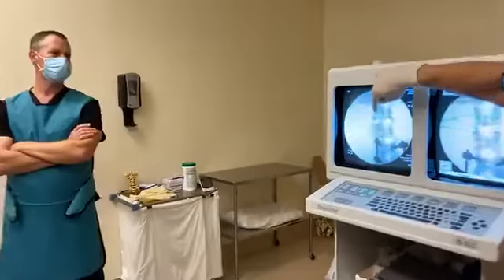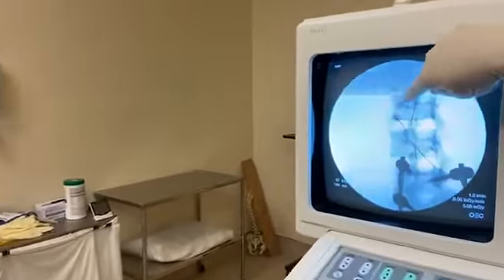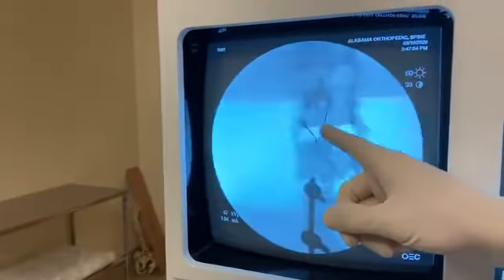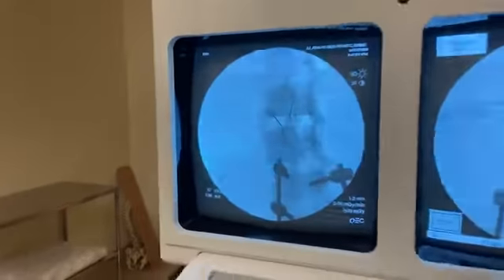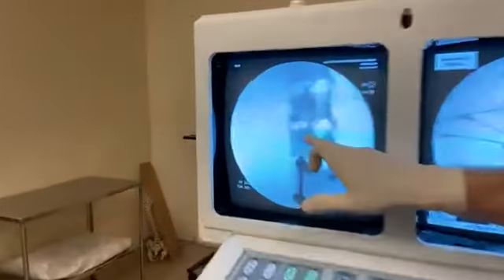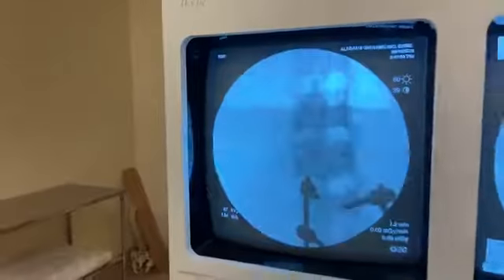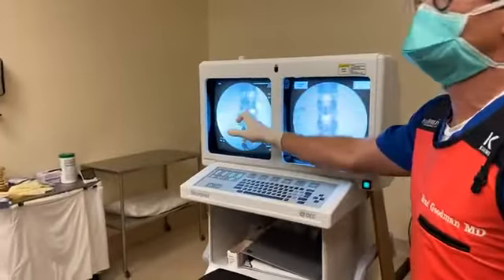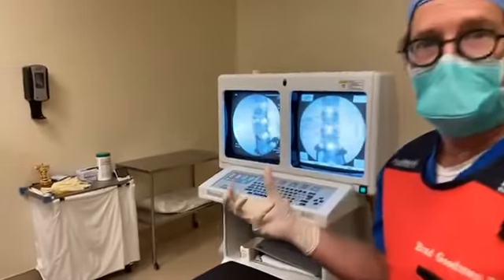Okay? These two needles are really blocking needles. This would be the RF needle, and this is a needle that's actually in the joint. So you wouldn't do all of this. You would just lay the needles along the nerves and burn. Okay? But to get to that point, you might want to inject the joint and see how it would respond to the anesthetic.